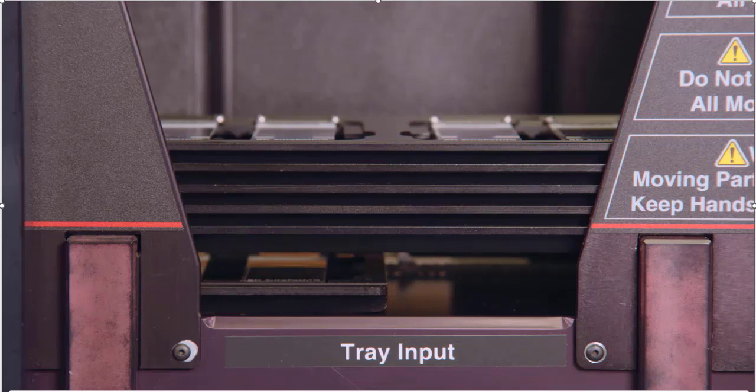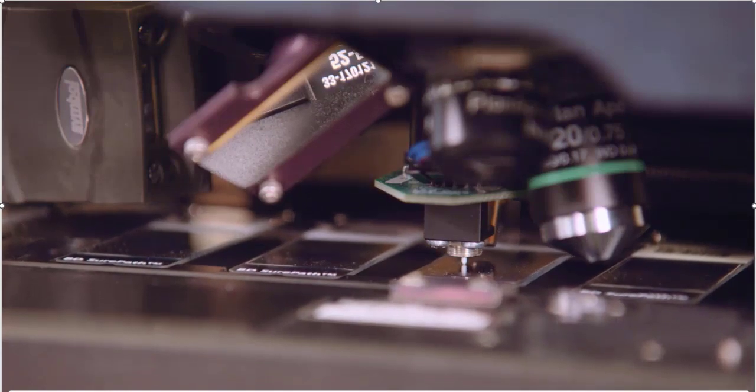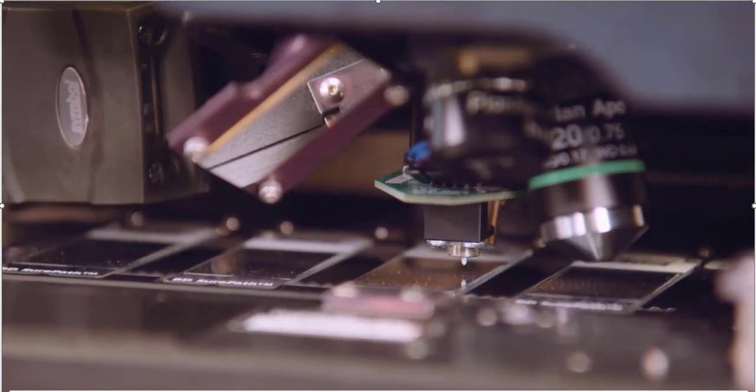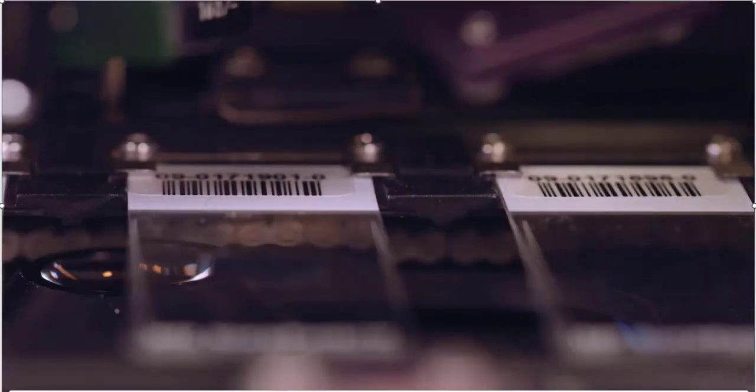The instrument will then perform a system integrity test to ensure all mechanics are operating within specified limits. A touch sensor will then assess proper positioning before imaging begins and the barcode is scanned.